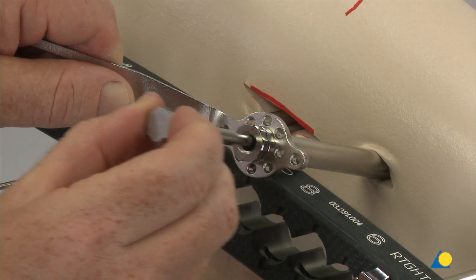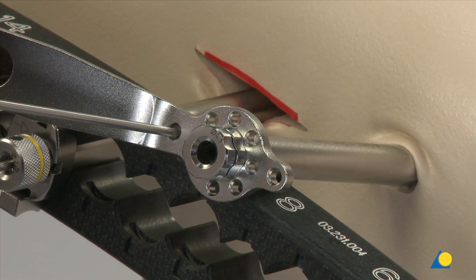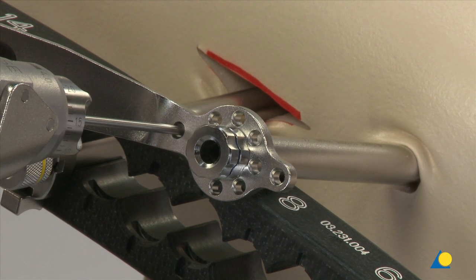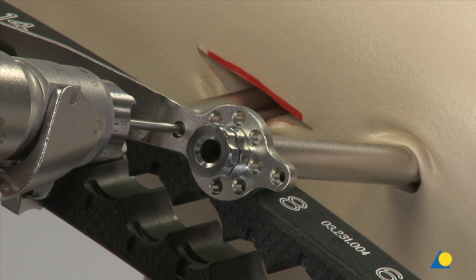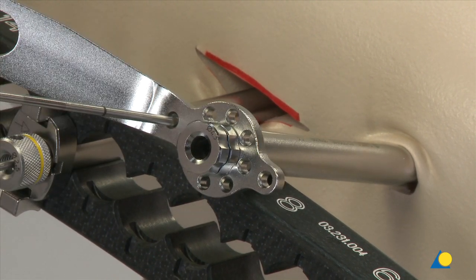Remove the trocar. Insert a 2.5 mm guide wire through one of the wire holes around the central hole of the protection sleeve and into the bone. The assembly is now provisionally fixed at the desired angle. Depending on the guide wire location, the wire may need to be cut to allow room for drilling.